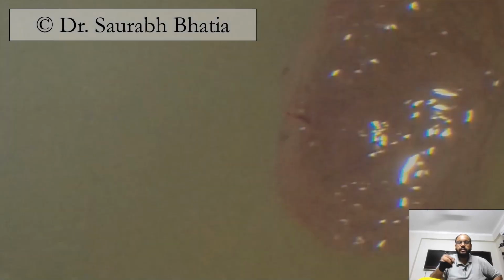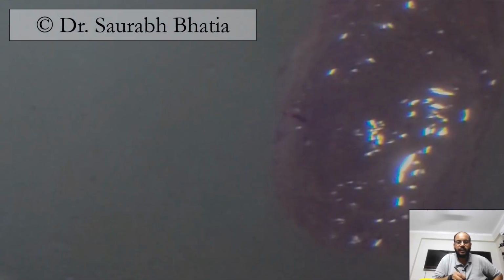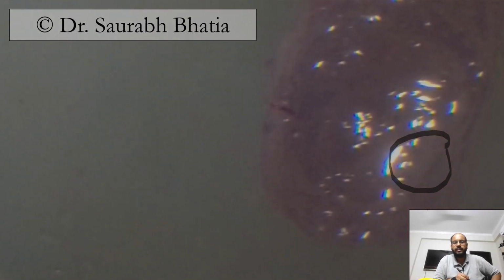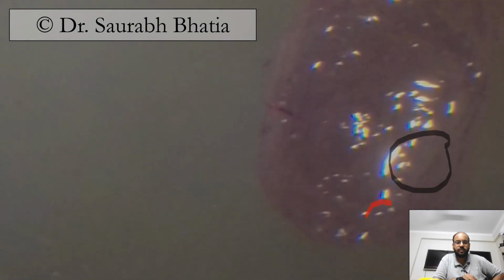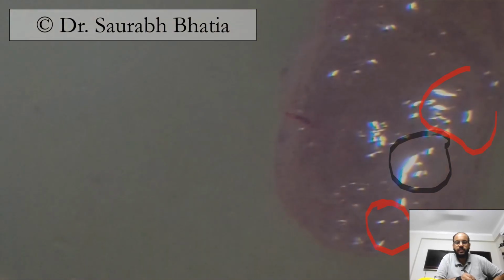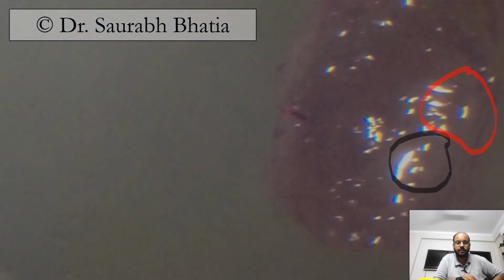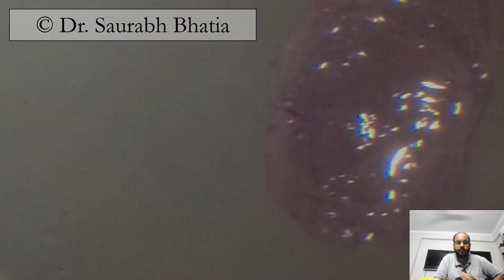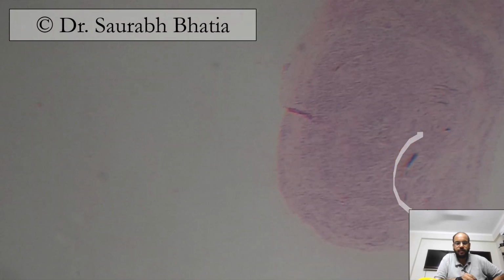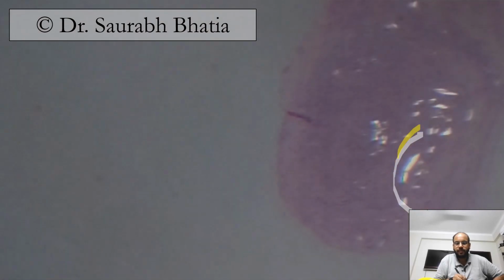And here, if you look at this video, can you see this glowing thing under a polarized microscope? Let me see if I can change the, okay, look at all the glowy thing. Just a second.